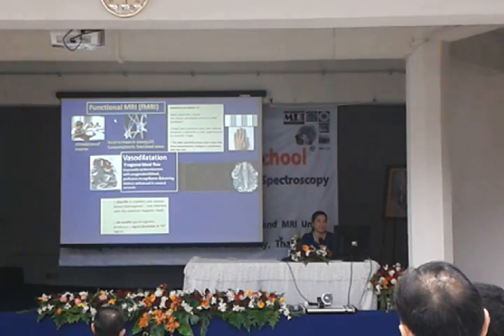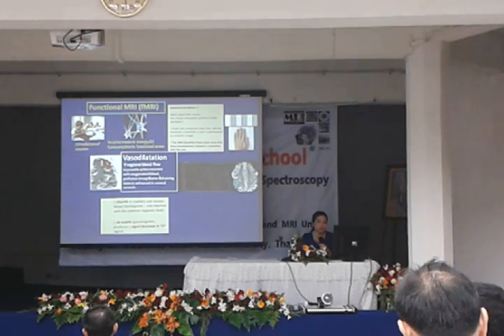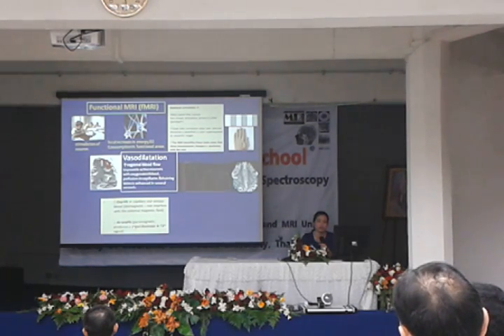That we already knew from this morning session. The principle of functional MRI depends on both techniques, right? At first, we have to stimulate the neuron and check the neuron working, and there is a difference when the neuron is working and consuming oxygen, and then there is the difference between oxyhemoglobin and deoxyhemoglobin, which induces field shift and increases the T2 star signal.